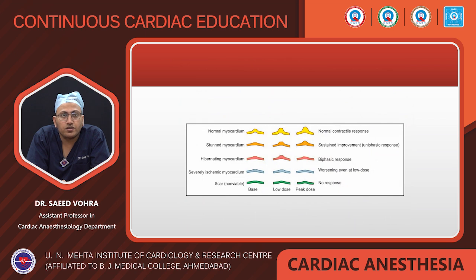Now this is a pictorial depiction of the dobutamine stress echo. In normal myocardium, at rest the contractility is normal and it increases at a low dose of dobutamine, and increases further at a high dose of dobutamine, which is a normal contractile response. In stunned myocardium, at rest the contractility is low, it increases with a low dose of dobutamine, it increases further with a high dose of dobutamine, and there is a uniphasic response.